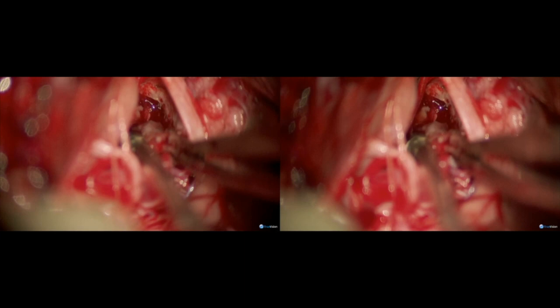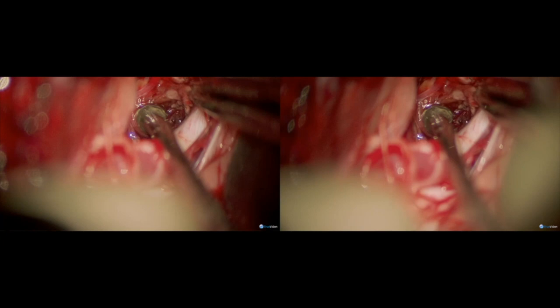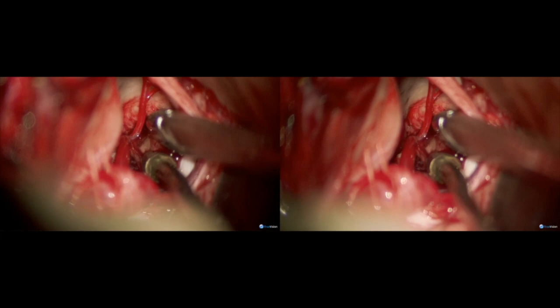Once a decent amount of dissection has been performed, it is useful to partially debulk the cavernous malformation so that it is easier to work with. The goal should generally be to remove the malformation in as few pieces as possible, so as to maintain a dissection plane and avoid leaving residual. That being said, removing the malformation in a piecemeal fashion is less traumatic to surrounding parenchyma and allows for a smaller pial opening. As such, it's a fine balance and a judgment call to determine when the dissected lesion is becoming too bulky to work with, prompting the surgeon to debulk it by removing a piece. It is important to remember that when removing these pieces, not to remove too large a piece and lose the established dissection plane, as this may become tricky to re-establish at the depth of the resection cavity when it is partially collapsed. The use of pituitary forceps can provide better purchase for larger pieces.